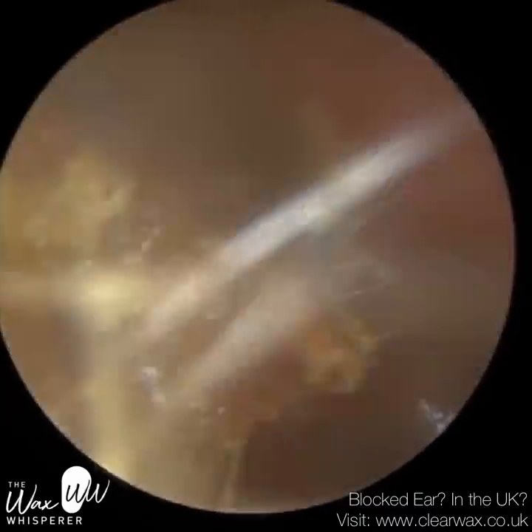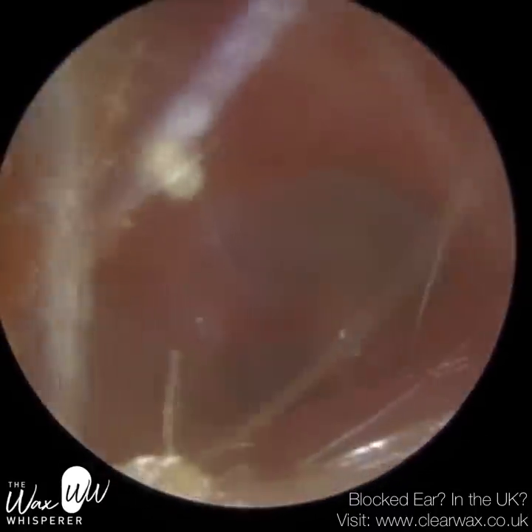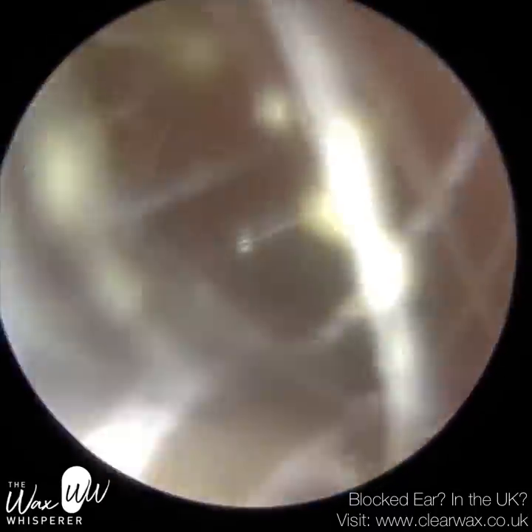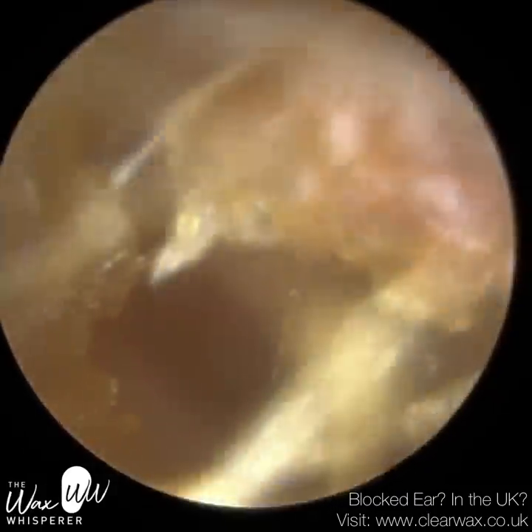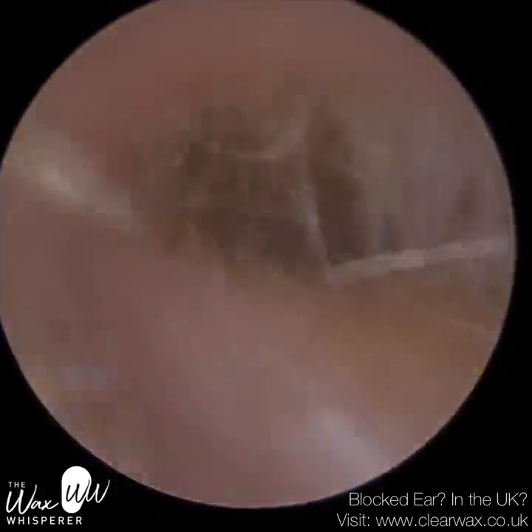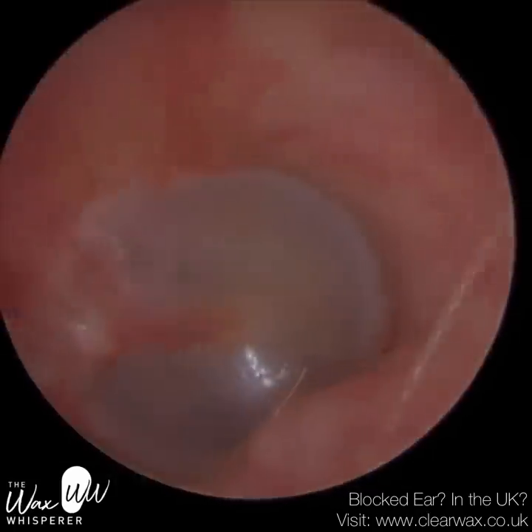I'm just using the fine end here. I'm just peeling the skin off the roof of the ear canal and the anterior section. This skin, if I didn't remove it, would have eventually formed part of that plug of dead skin that I removed.